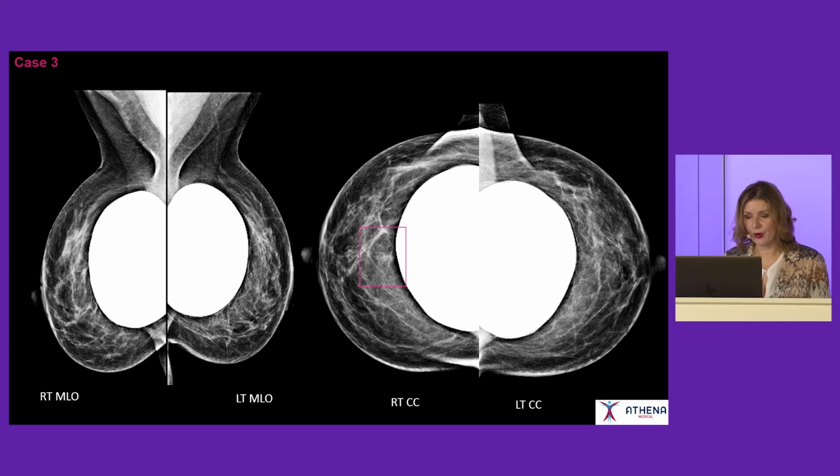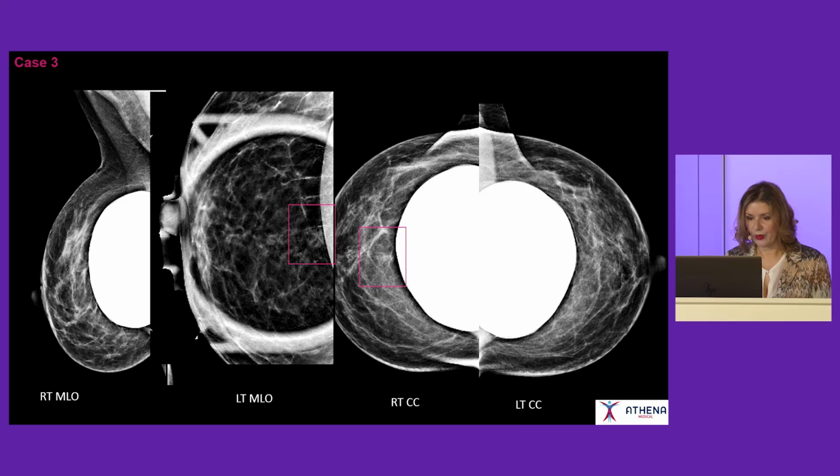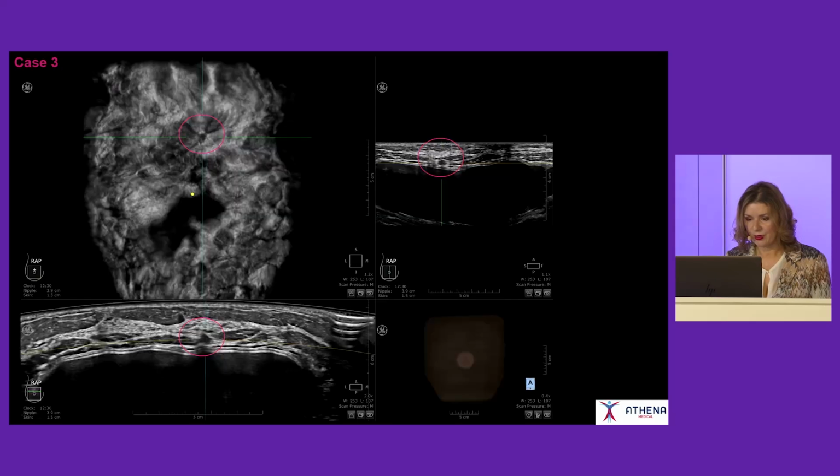So we found on her mammogram just an asymmetry, which is very faint, and we cannot see it in any other image because of the breast implants. It makes our reading more difficult. We perform a focal view in this area to get more information. You see it doesn't spread out.